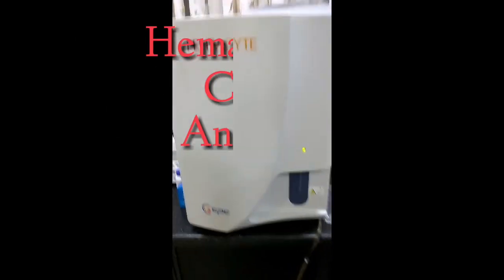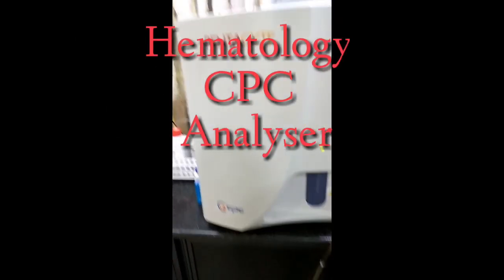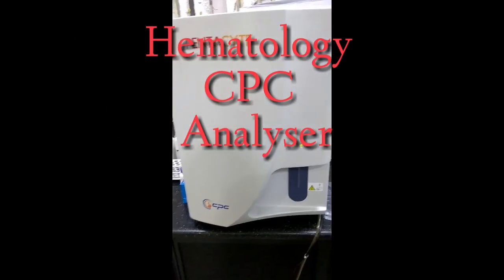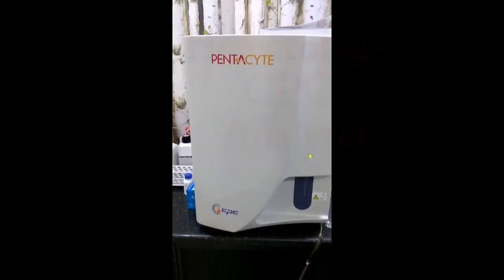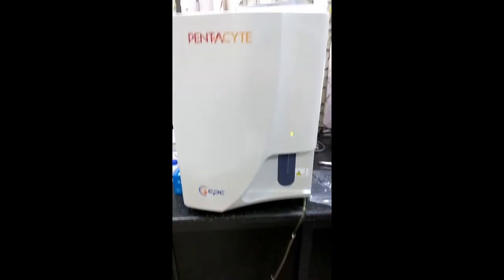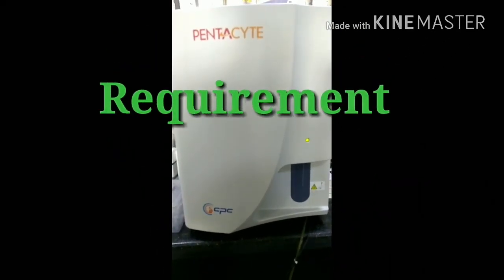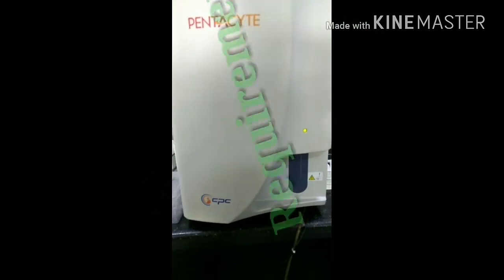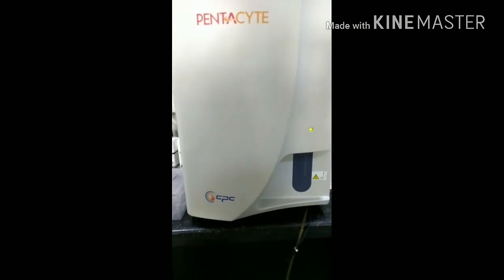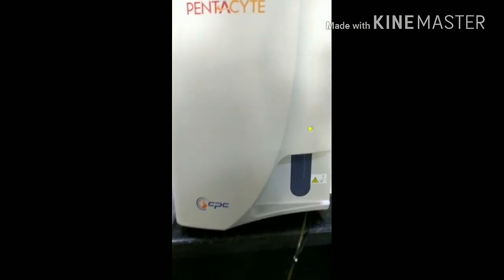Hello everyone, we are looking at Pentacyte company 5 part machine. We will see what we have to do in 5 part CBC machine. We will review this machine.